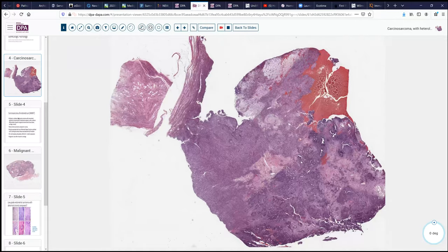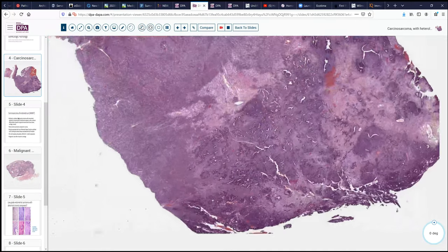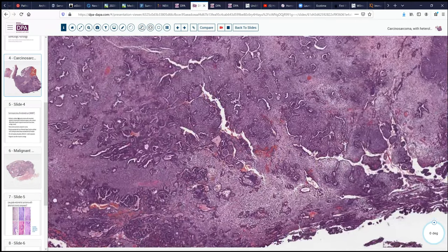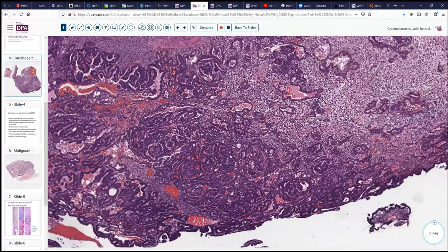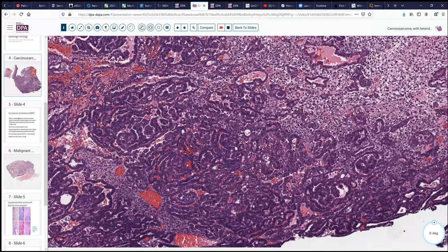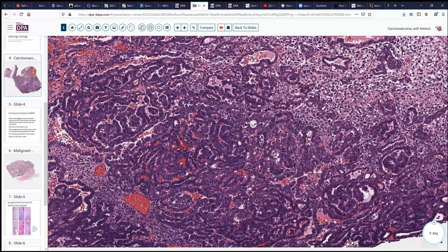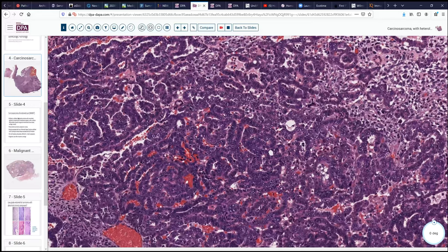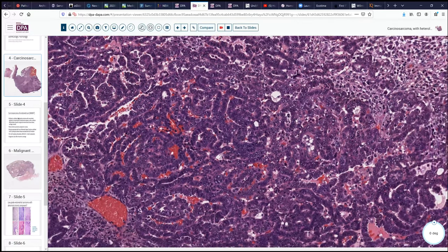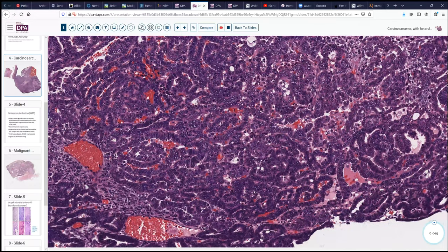Looking at the endometrial type surface, in this particular area the tumor has a strong resemblance to uterine papillary serous carcinoma: very high-grade nuclei, small micropapillary formations, small glands, high NC ratios, and abundant mitotic figures. So it's easy to understand how this could be sampled with a curettage or biopsy and be interpreted as endometrial carcinoma, end of story.